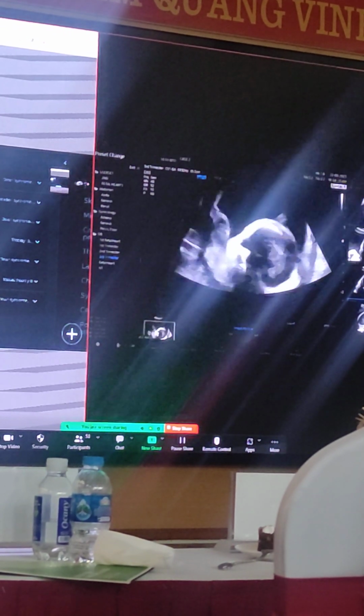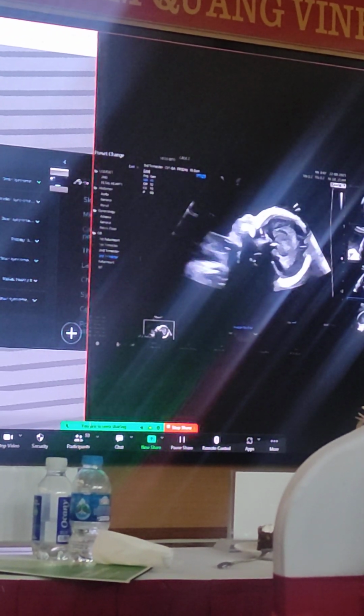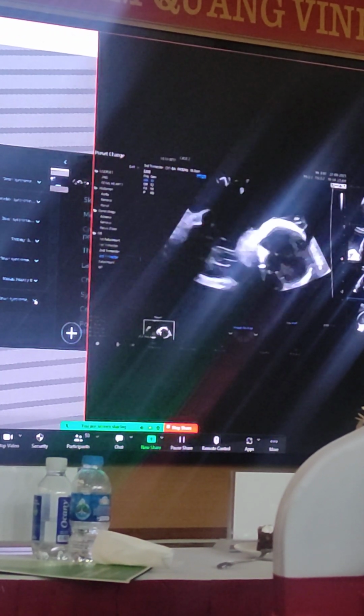So look at the face, you look at the face itself, and you look at the profile. So this is a profile of this baby.